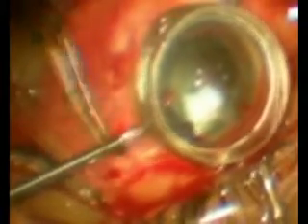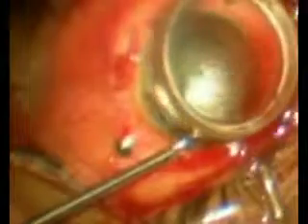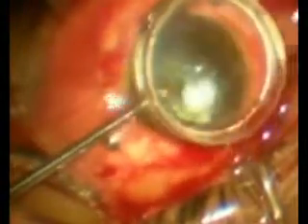The magnet was taken out, and now we opted for putting in an intraocular foreign body forceps through the same paralimbal incision. Several attempts were made to hold the foreign body with the forceps. However, the forceps being in the left hand, which is the non-dominant hand of the surgeon, a proper grip was not achieved.